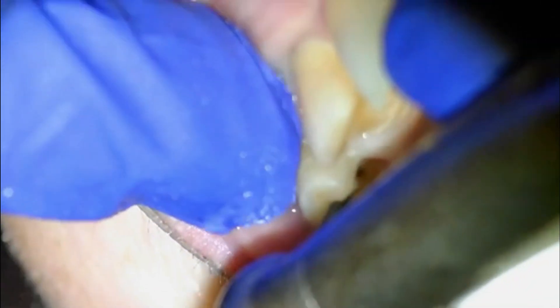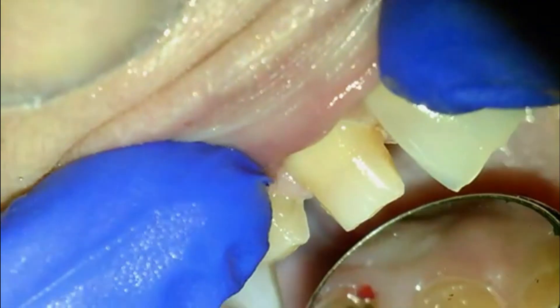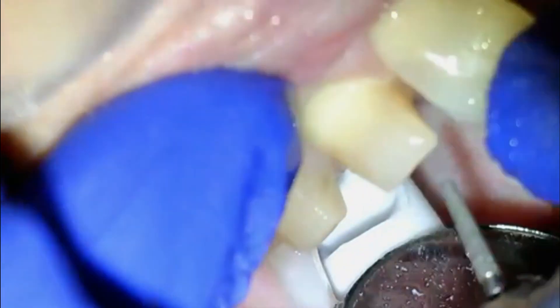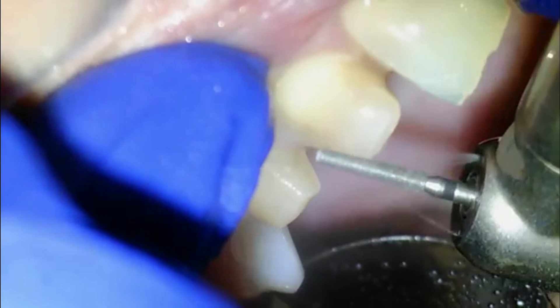I'm constantly checking and rechecking the occlusion to see how much space I have. I continue to remove more off the incisal edge, and every time you do, you have to round it off to make sure you don't leave sharp corners. Rounding off the tip is not only going to relieve those stress areas, but it's going to give the lab just a little bit more to work with — to make them that much more perfect. That little bit you give the lab is going to be just enough to make sure you don't get show-through with your prep, because we will be using a translucent zirconia, which is still opaque enough to block out the tetracycline staining.